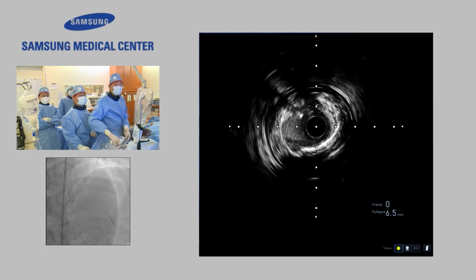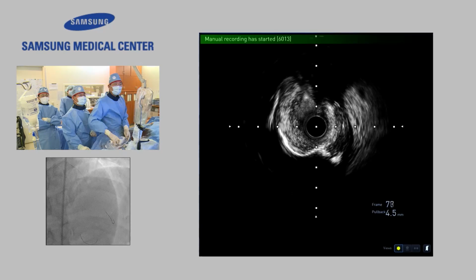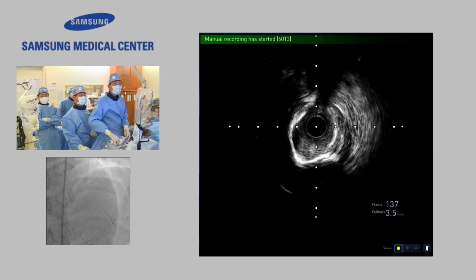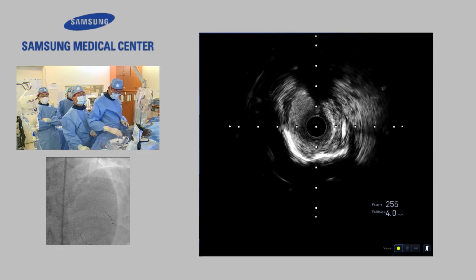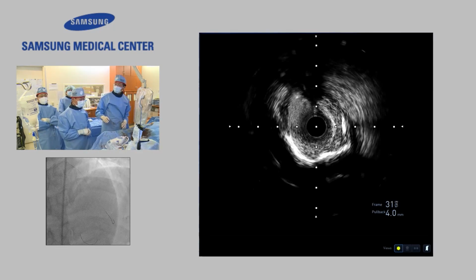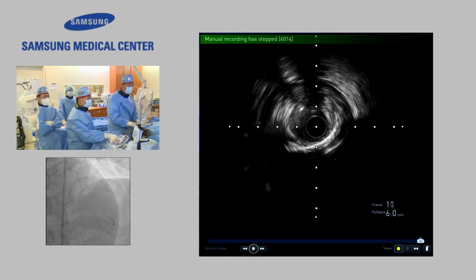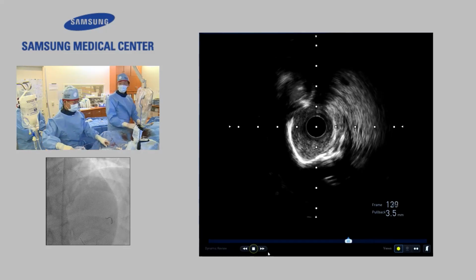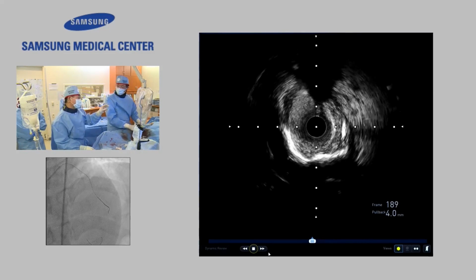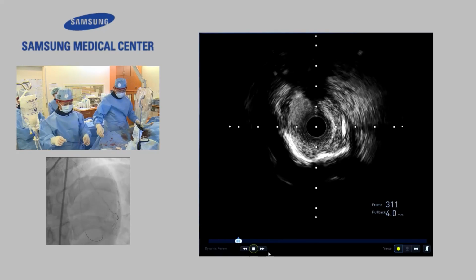Proximally, I push the IVUS catheter here, proximal to inside the lumen. Of course, there is a lot of plaque. Anyway, we dilate the diagonal, and hopefully I would like to finish with the DCB. For the diagonal, is that a good idea? I prefer two stents. If you want, I can do that.